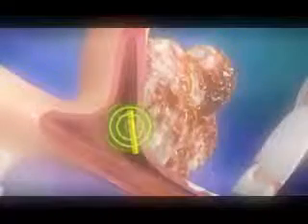The patient is then set up on a table by our therapist. The treatment lasts anywhere from 30 minutes to an hour and a half for most patients. The beauty of CyberKnife is that it can track patients' breathing. The patient has the gold seeds inside the lung, and then we also place LED lights across the patient's chest.